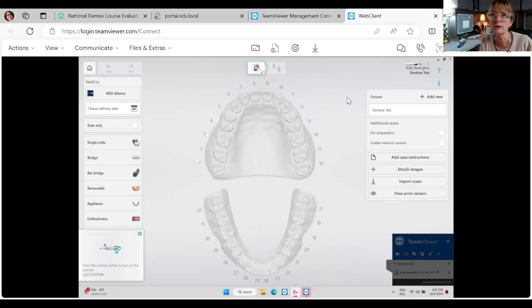So, and it's really by demand, right? What our customers are looking for. And we become certified with the different scanner manufacturers. So if there's a particular one of interest, let me know so that we can learn more about it to better support your needs.